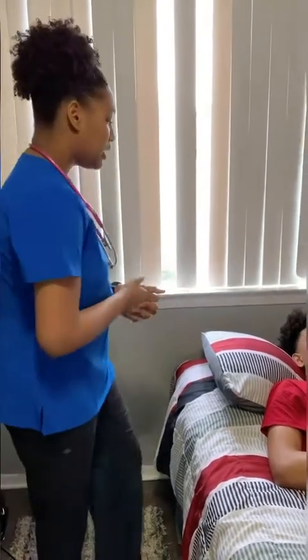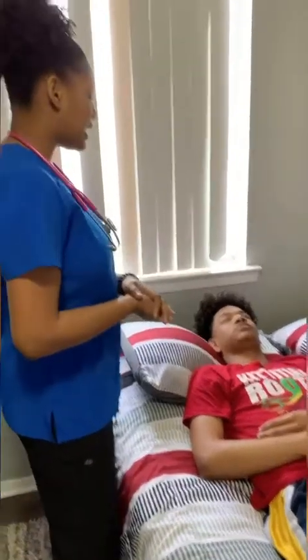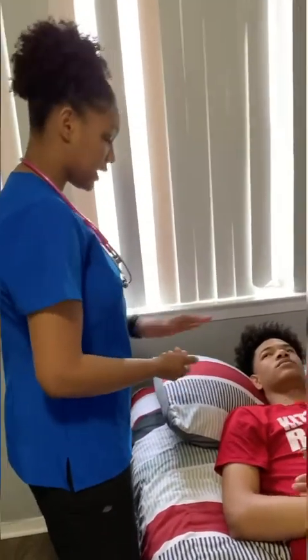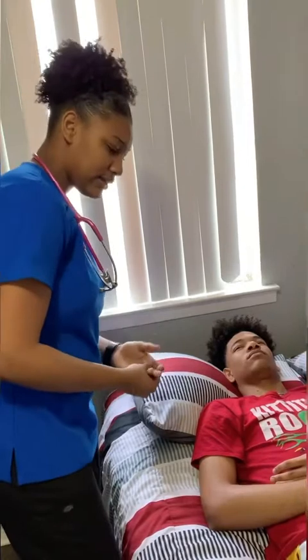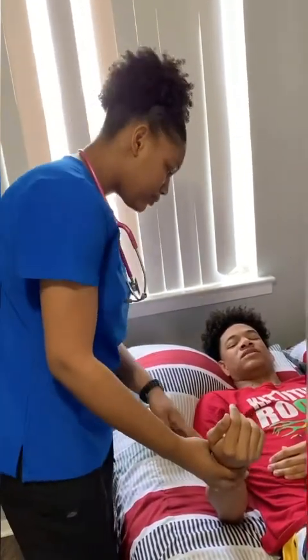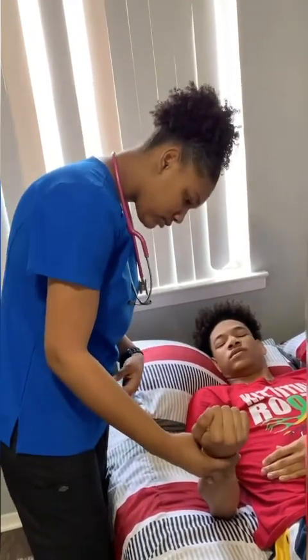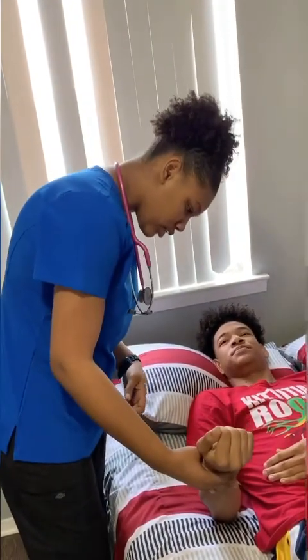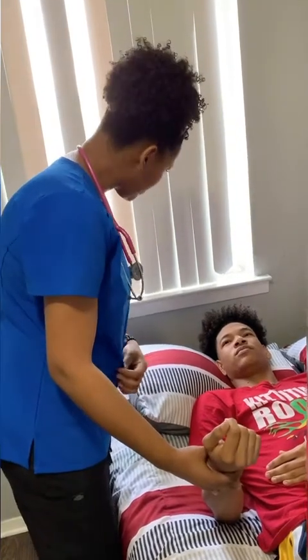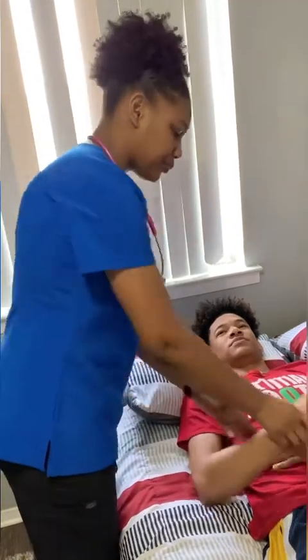Okay. Good day, Mr. Pereville. Good day. Yes, I am Nurse Rae-Yanne, and I will be taking your vitals today. Before I begin, could I get your first and last name? TJ Pereville. Okay, and what is your date of birth? 2012, September 6th. Okay, can you repeat the year for me? I'm sorry, 2004. Okay, thank you.